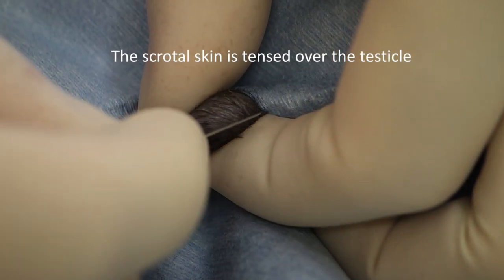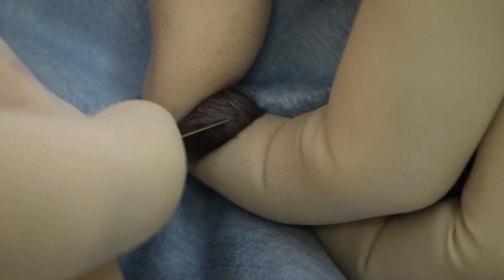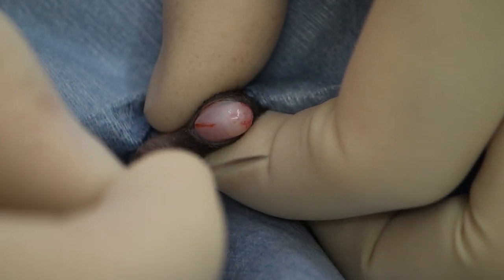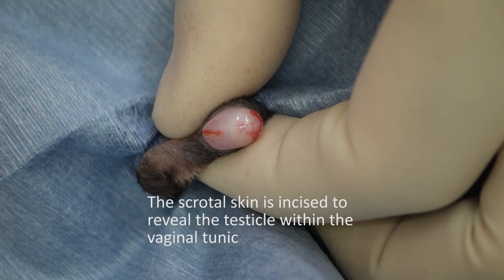We grasp one of the testicles and tense it against the scrotal skin and make our incision — just through the skin, not into the underlying vaginal tunics.